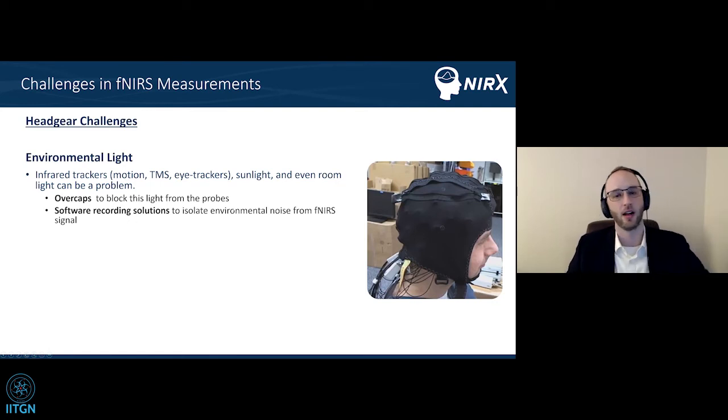We're able to tell right when we're setting up the system how much environmental noise is there right now? Is it actually a problem? Is there anything that we can do about it? Which is really critical. Cap fit and size is also important, of course.